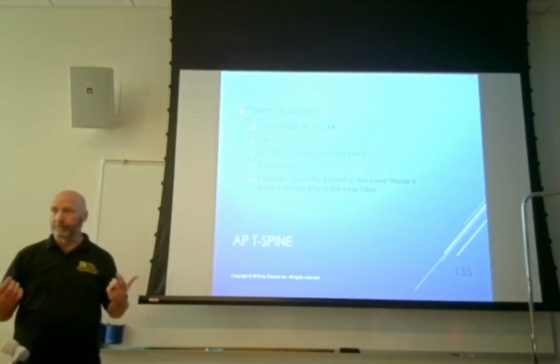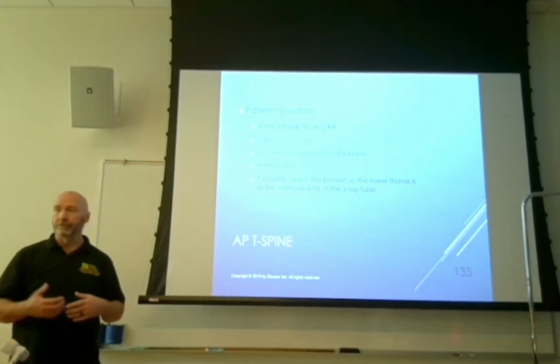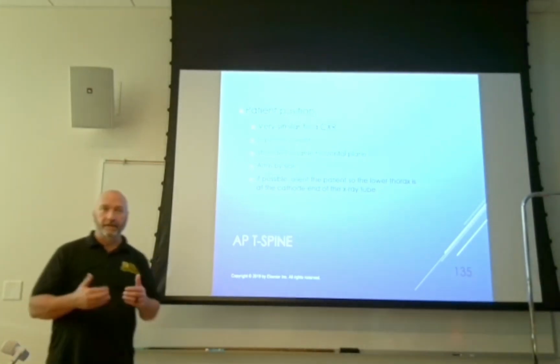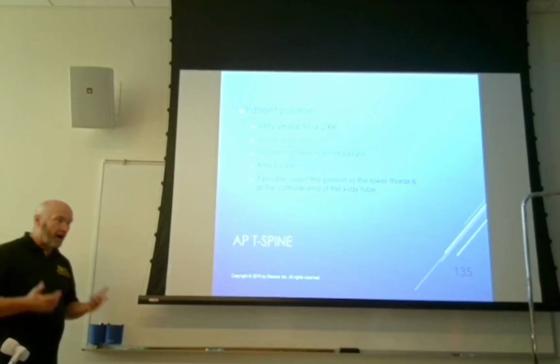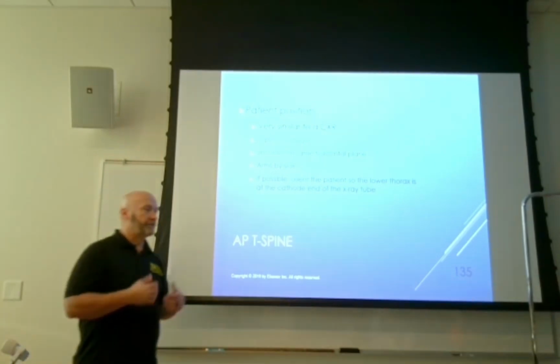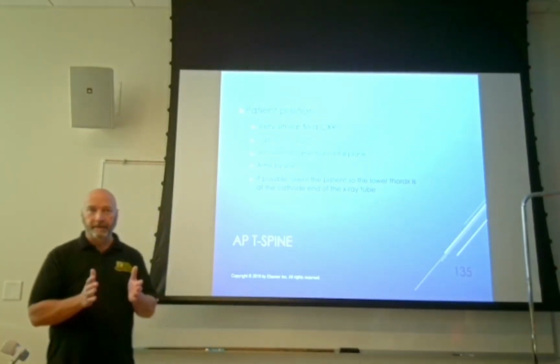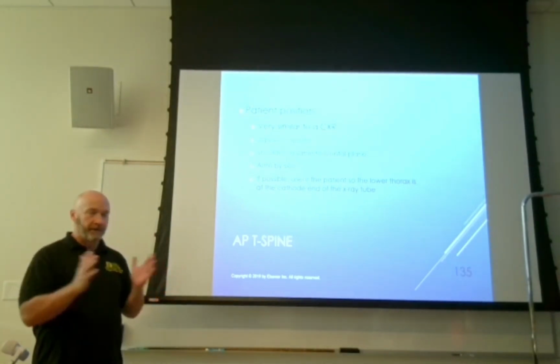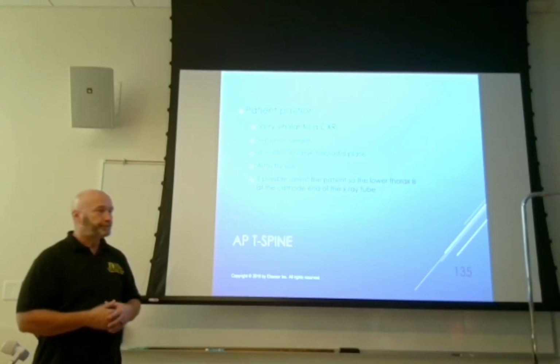Okay, no difference between 1.5 above the shoulders, top of the image receptor, central ray to T7, just like on a chest x-ray. The obvious difference is if you're just shooting for the T-spine, you're going to collimate, right? Instead of using the outer cells, you're going to use that inner cell. You're going to collimate in just the T-spine.